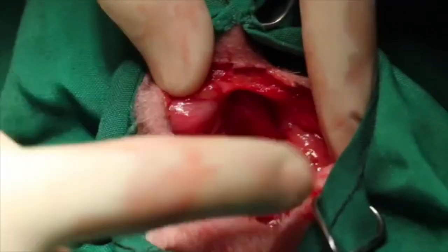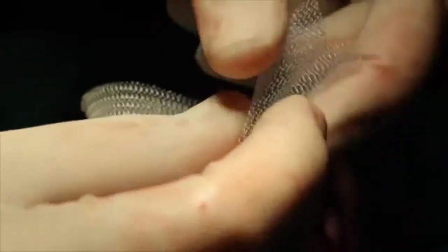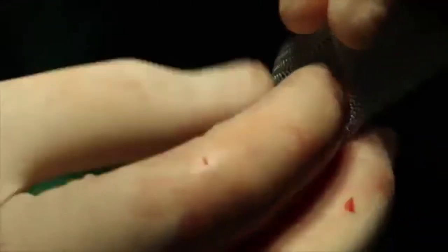and have that risk of you getting bit and them getting stressed, para lang matanggal yung suture when you have a lot of sutures to choose from. Okay, so what you do is you have a mesh. Okay, you're gonna replace that wall with a mesh. You're going to cut it in a certain way and shape it in a certain way that will fit the shape of the hole that you want to fill. Okay.